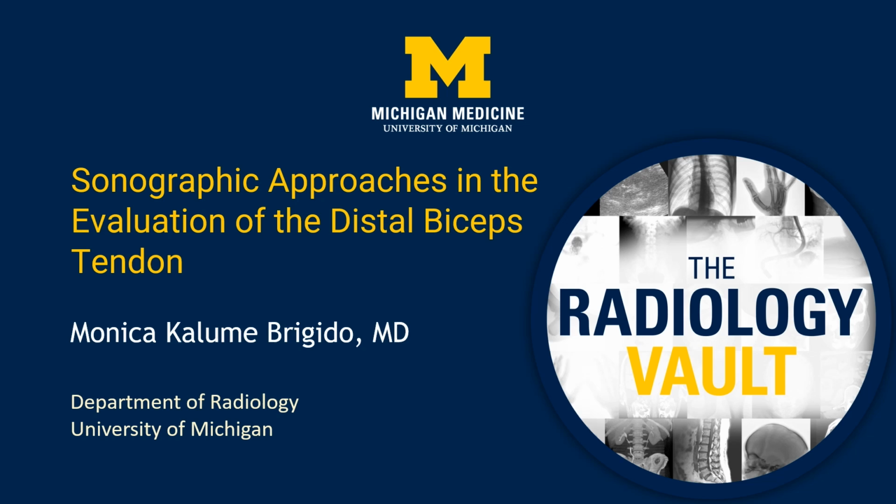Hello, my name is Kalume Brigido. I'm one of the Musculoskeletal Radiologists at the University of Michigan. The topic today is sonographic approaches in the evaluation of the distal biceps tendon.